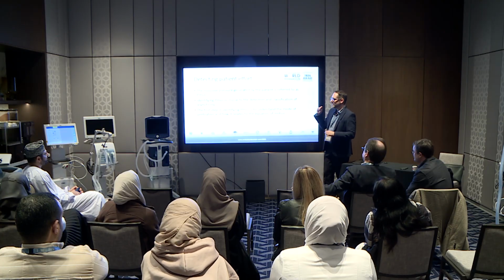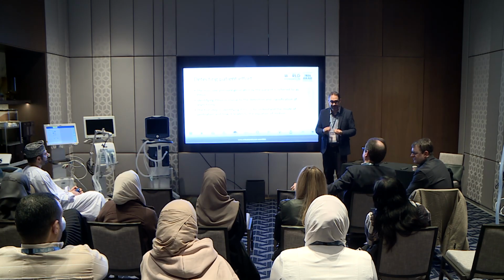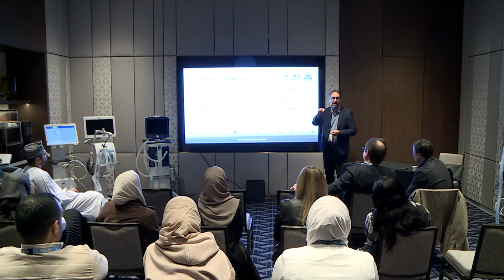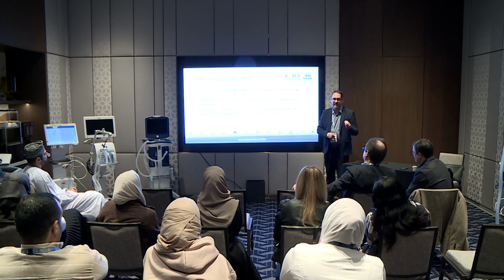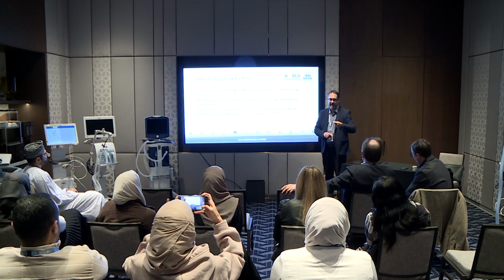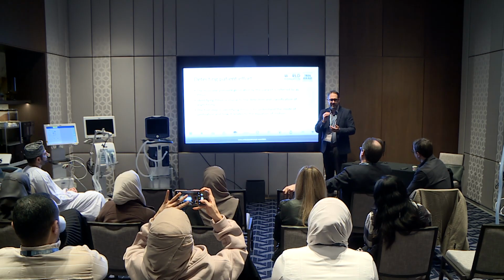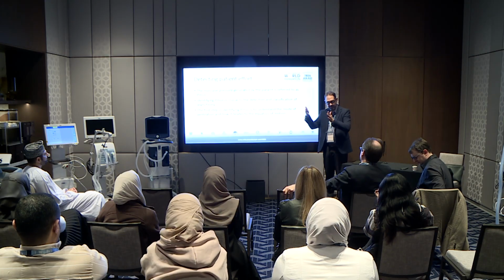First of all, the key to understanding how to recognize asynchrony is to make sure that you understand how to detect patient effort. Many ventilators will tell you the patient triggered the breath. It'll either have lungs that pop up on the screen, or you'll see a different color in the waveform, and we'll see examples. It's very clear that the patient's triggering. That's really the first step to identifying asynchrony: did they trigger the breath? Because in one form of asynchrony, the patient would not trigger the breath, but then they would respond afterwards. It's called reverse triggering. So first thing is, did they trigger that breath?